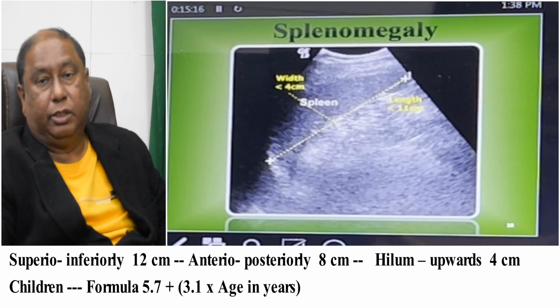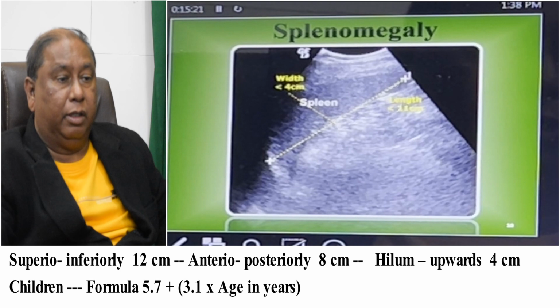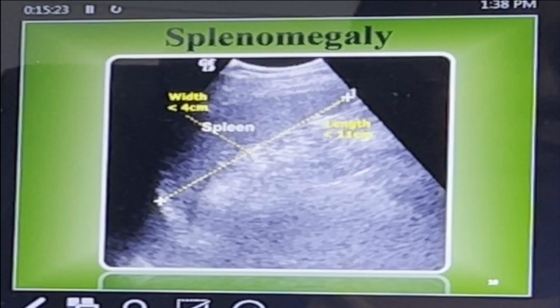The size should not be more than 12 centimeter inferiorly. Here you have to measure from here to here. It would be around 12 centimeter.